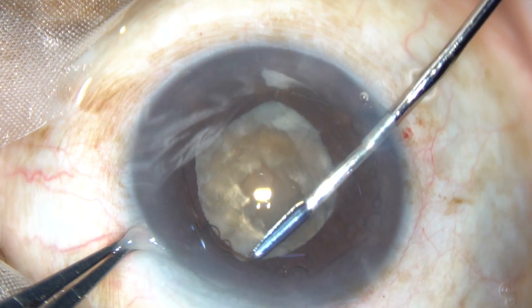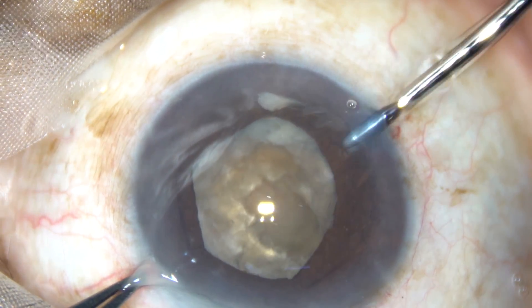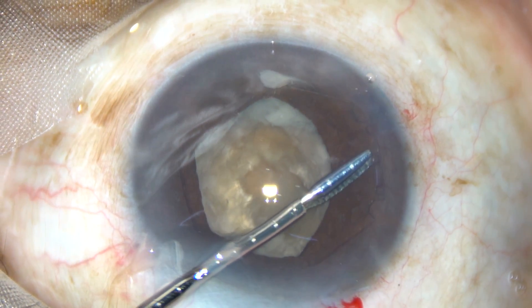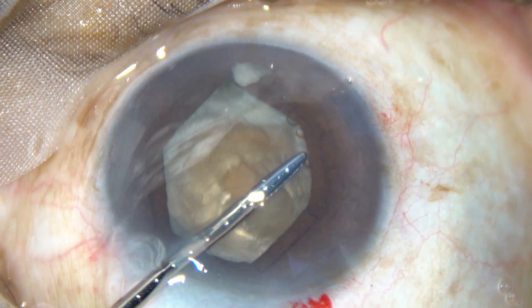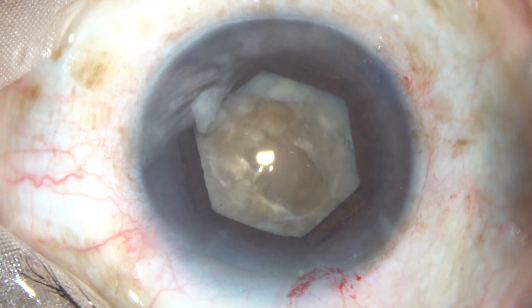This is known as B-Hex forceps — a crocodile forceps, 23 gauge. It is a very thin device and doesn't need any injector system; you just need these forceps for easy application. Alternate flanges with manipulation holes are tucked under the iris, and after you apply the device the pupil takes a hexagonal shape.